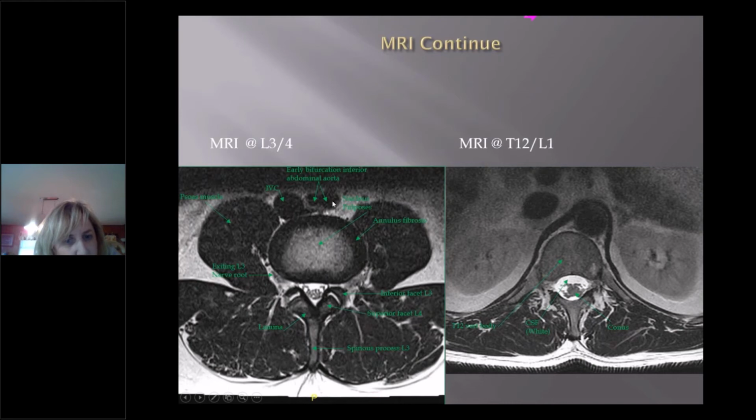And then you actually can see the arteries and veins really good. Here's the inferior vena cava, and then this is just as the abdominal aorta is bifurcating, getting ready to split further to go down into the legs. So you get some really good detail there, and I've found a few AAAs on MRI because they'll actually include enough of the vessels to be able to look at that and go, oh wow, that thing really dilates, and then you'll be able to diagnose a AAA if that's the case.